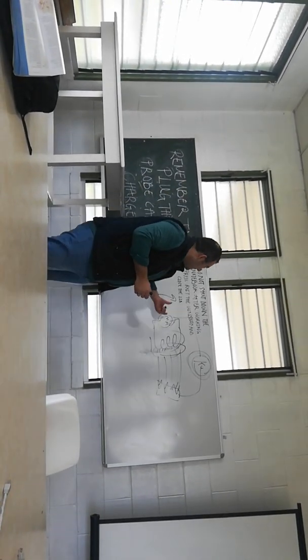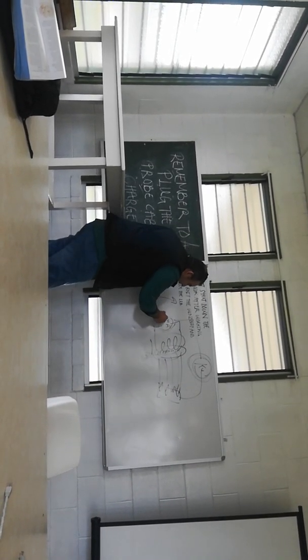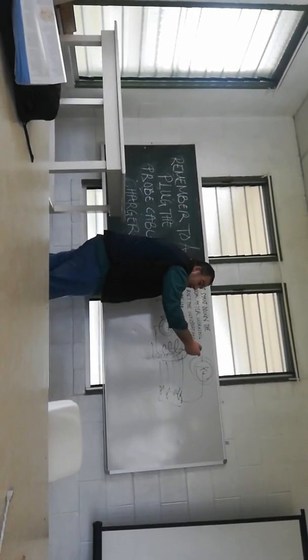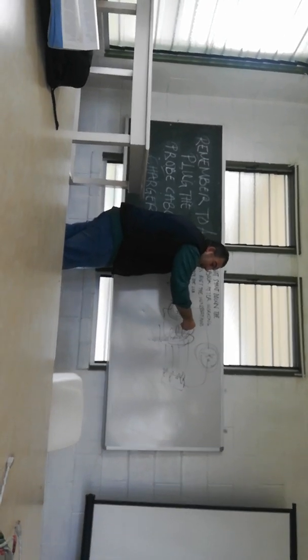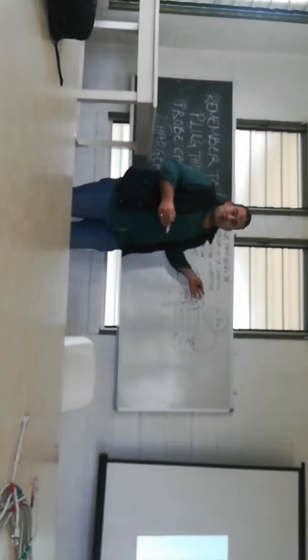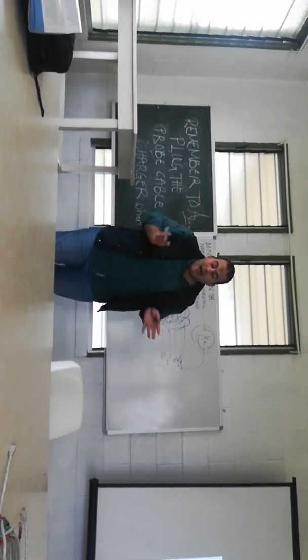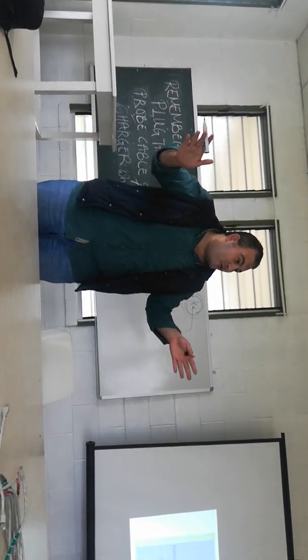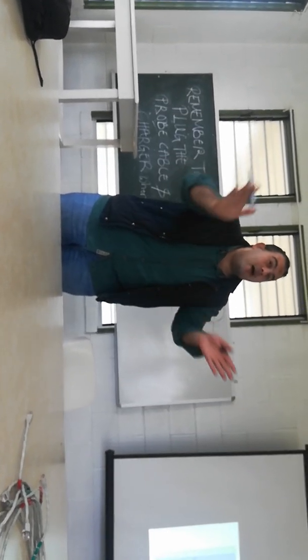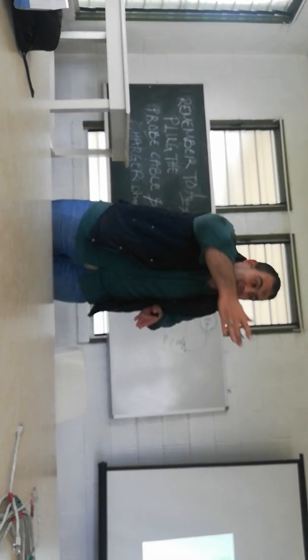But if I increase the value of milliampere, the heating of the filament will be increased, so the electrons liberated from the filament will be increased, so the probability of interaction of electrons with target atoms will be increased, so the amount of photons produced will be increased. So milliampere directly affects the amount of X-ray photons, but kV directly affects their penetration power.